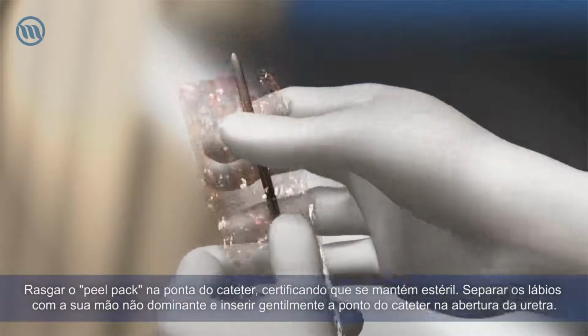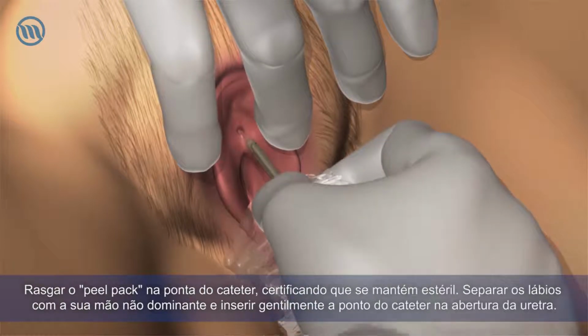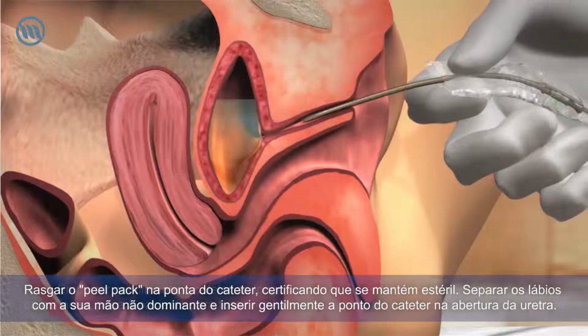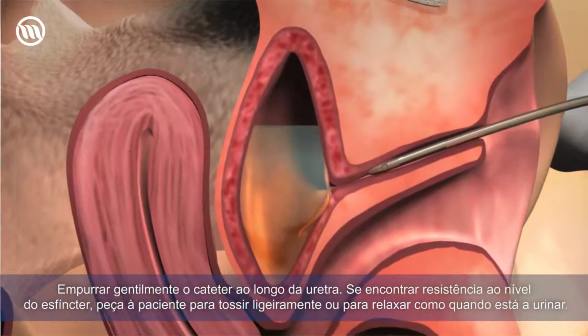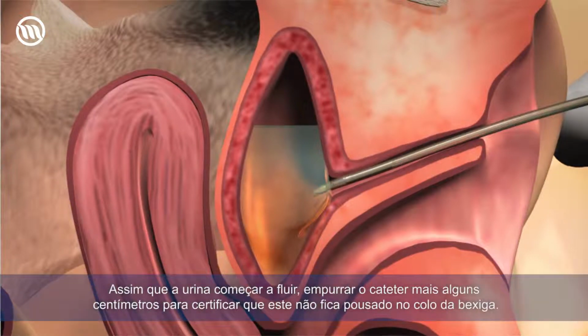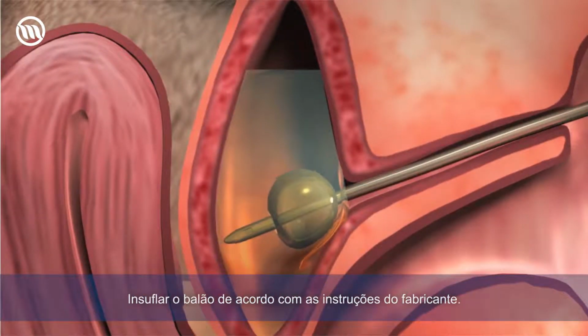Tear off the plastic sleeve at the tip of the catheter, ensuring the tip remains sterile. Part the labia with your non-dominant hand and gently insert the tip of the catheter into the meatus. Gently advance the catheter along the urethra. If resistance is met at the sphincter, ask the lady to give a little cough or to relax as if they are going to pass urine. Once urine starts to flow, insert the catheter a further couple of centimetres to ensure the catheter is not resting in the bladder neck. Inflate the balloon according to the manufacturer's instructions.